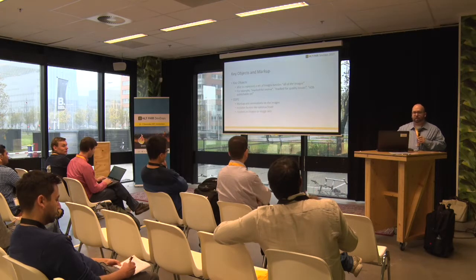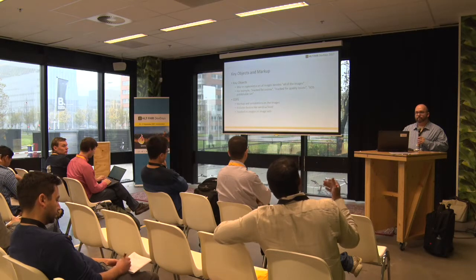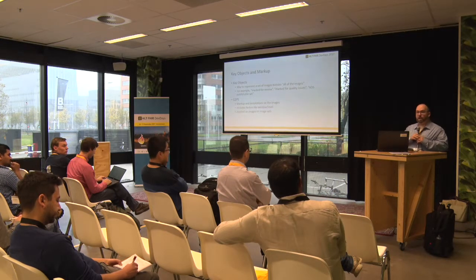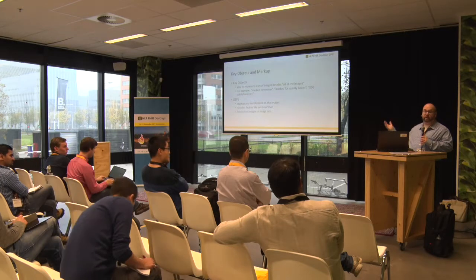So you're saying that if someone draws some annotation and burns it onto the image, it means that they have to change the UIDs. Good question. So no, when you create a markup, that's a layer that's a separate object that sits alongside the image.